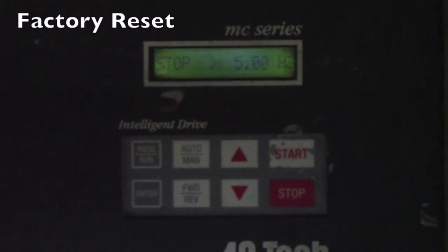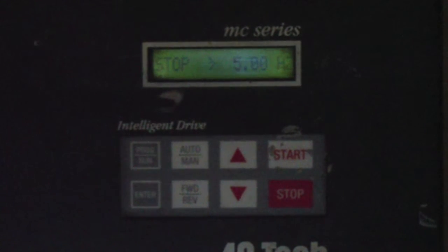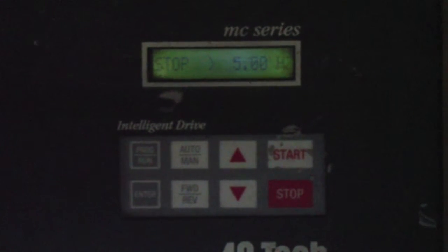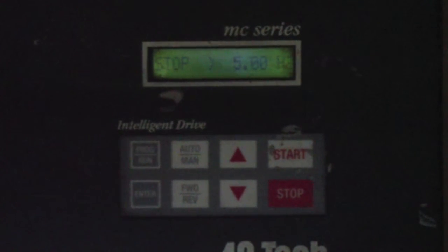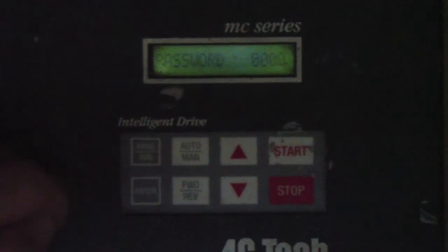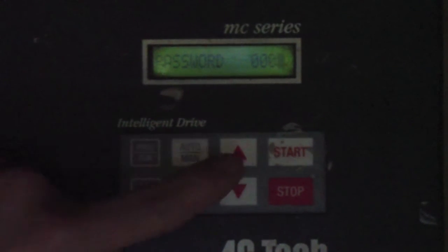In this video, we're going to show you how to do a factory reset on the AC-TEC controller. If for some reason the parameters have been changed and something has gone wrong, and you need to get the AC-TEC controller back to its default settings, this procedure will walk you through doing that. Walk over to your AC-TEC controller — it'll say Stop 5 Hz. Press the Program Run button; it'll prompt you for a password. Use the up arrow to go to parameter number 19.